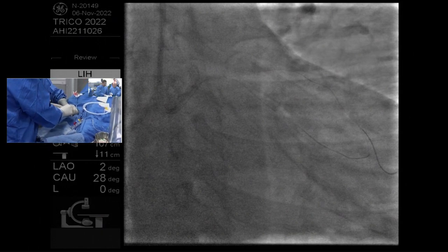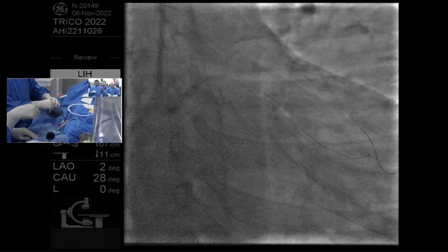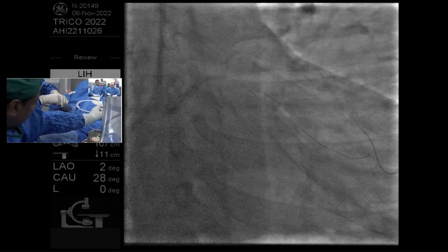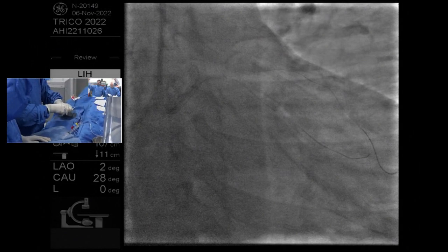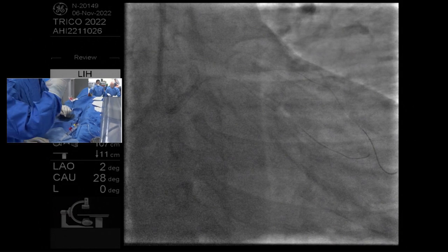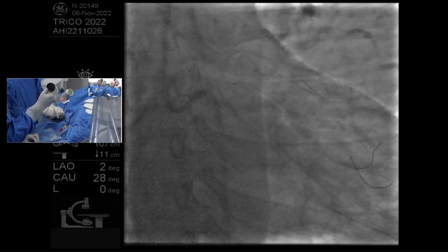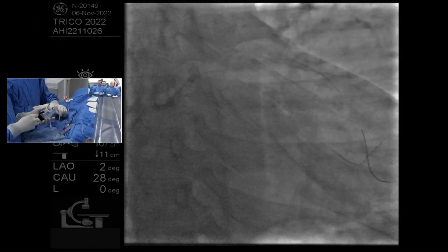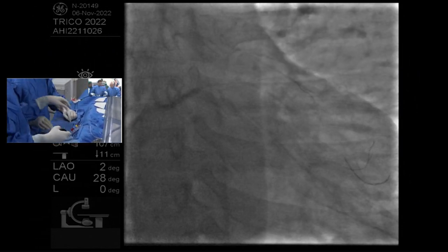So if you're going to increase support, you heard the anchor balloon, which here might work very well if you were to put an anchor balloon in the LAD lesion and then see if you can push a microcatheter across. You heard about guideliner, which with a query ostial left main lesion may not be the optimal choice, but you can always assess that, make sure it's not there, and then address. You can talk a little bit about putting anchor wires into other places within the coronary tree. And then, of course, there are small balloons, then grenadoplasty.